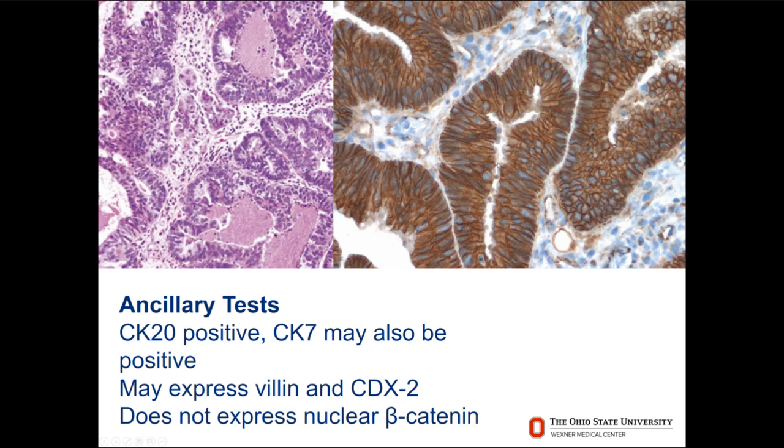If you look at this photomicrograph, you can see most of the staining in this primary bladder adenocarcinoma is cytoplasmic. The nuclear staining is 0. So that's a soft feature. I sometimes do a beta-catenin to distinguish these primary adenocarcinomas from colonic adenocarcinomas.